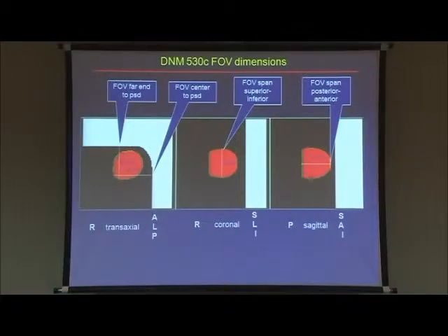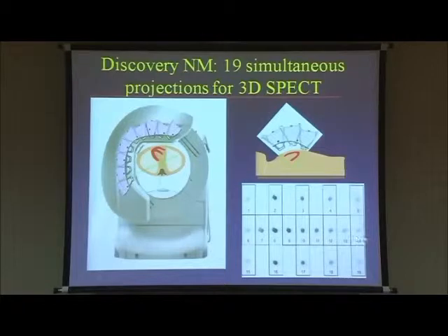So another reason, when you pay a lot for detectors, the field of view tends to be smaller. But this is quite large. It's difficult, and if I go back to the planar projections here, the detector will actually position the heart for you. So only in very unusual situations with someone who's learning would you get truncation, putting the heart out of the field of view.